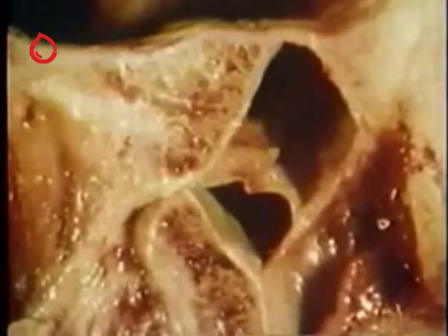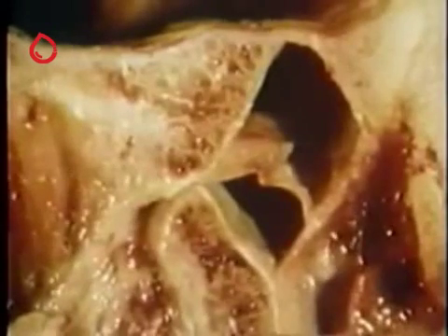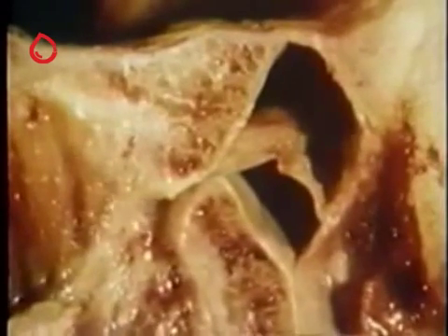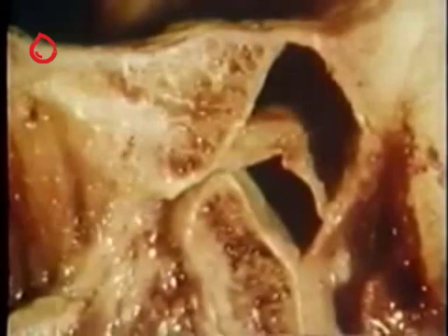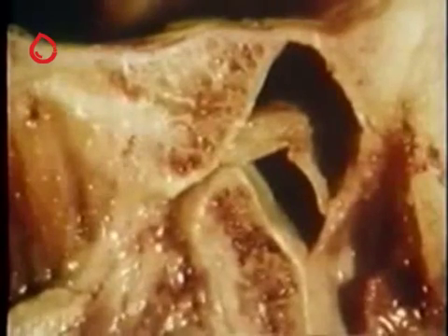The posterior attachment between the disc and capsule is considerably thinner than in a normal case.